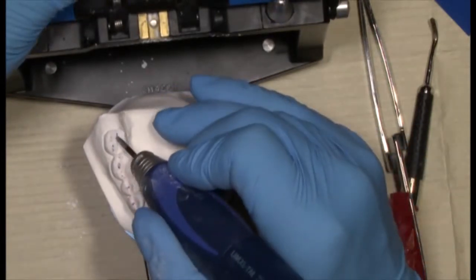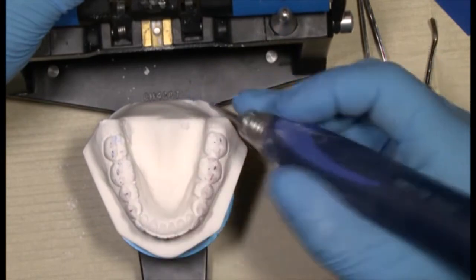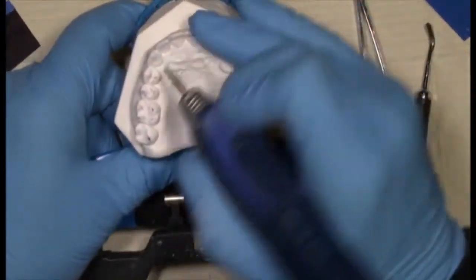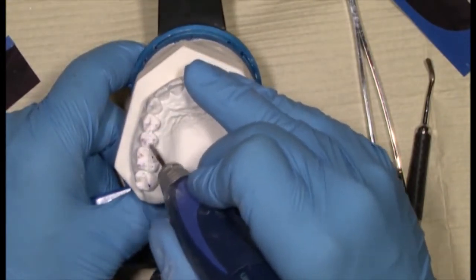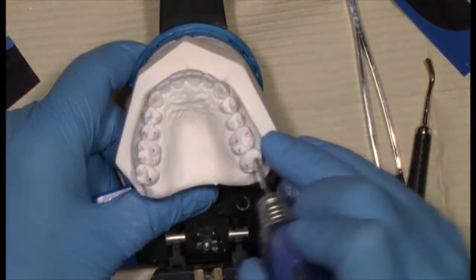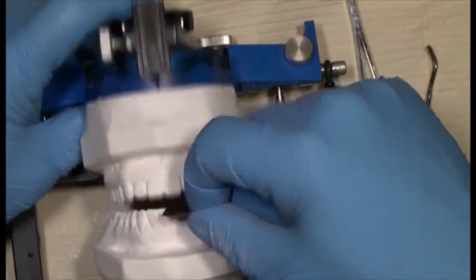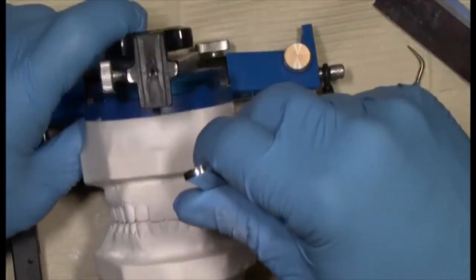So we continue. And remember, hopefully we can get all the way to the cuspids. And the comment in the manual is when the first cuspid comes in contact, think about stopping. Use the red.